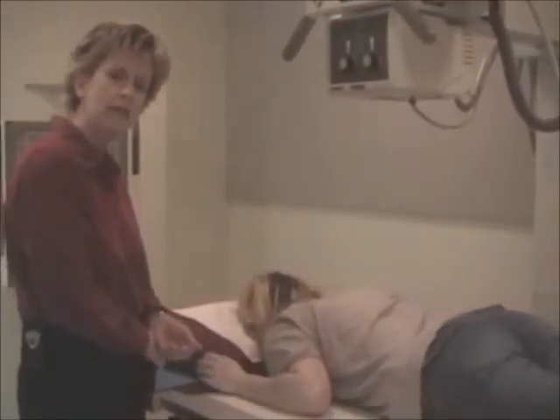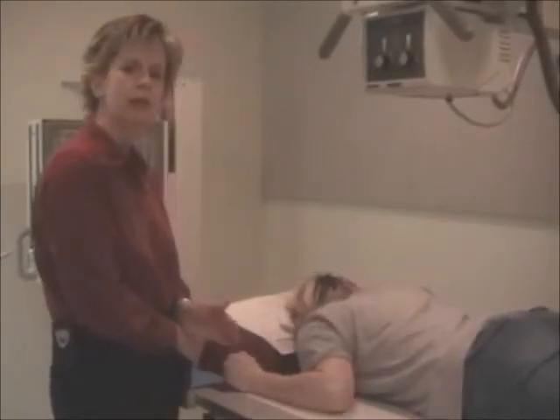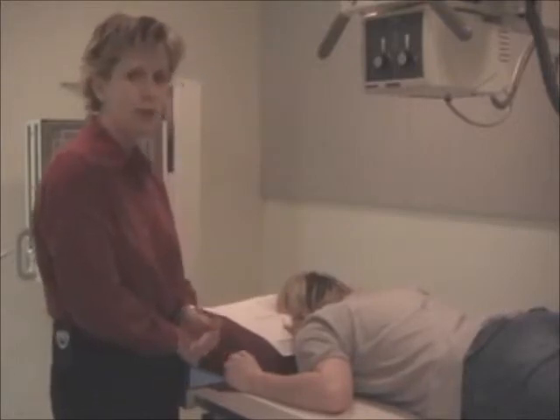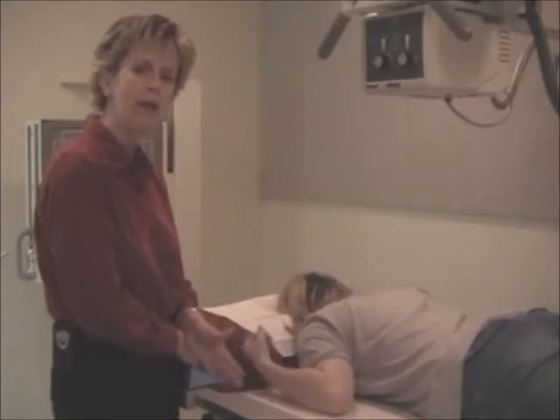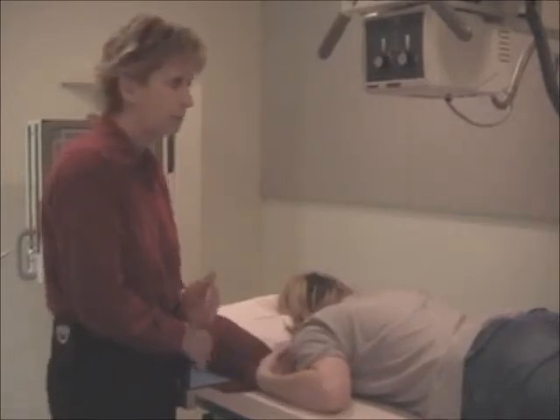If you're not doing a small bowel follow-through, but the protocol calls for a 14/17 of the stomach, try to do that one near the end of the procedure, because the purpose of the big film is for small bowel. The purpose of a big 14/17 film is not for the upper GI, it's for the small bowel. And the small bowel is distal to the stomach.